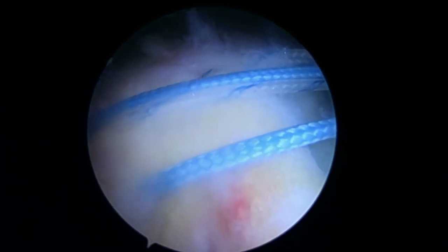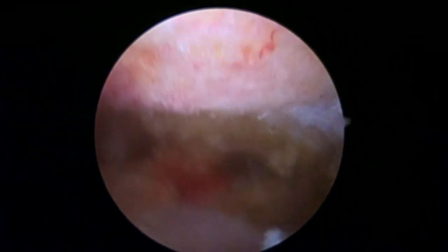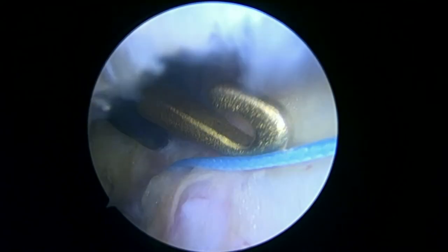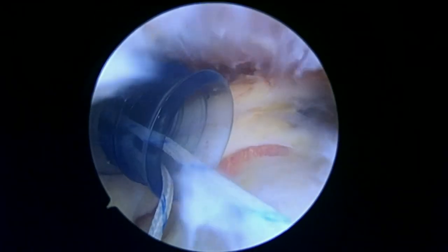And so we're gonna tie these ripstop sutures, and that should do the trick. In terms of the decompression, there's the work on the bone there. And that looks good. You did a little bit of work on the clavicle also, which we often have to do. So we're going to go ahead now and take these sutures one set at a time. We're going to start with the blue and white ones. And you can see how we can retrieve those so that they're now inside this cannula, and we're going to tie those in just a minute.